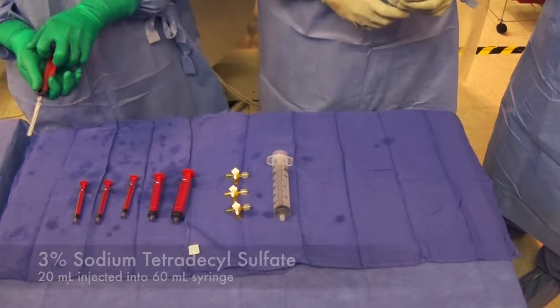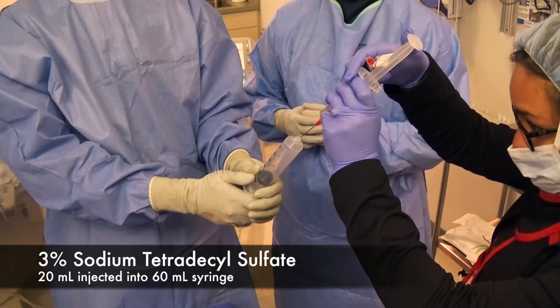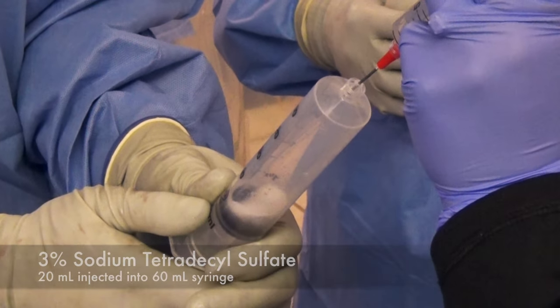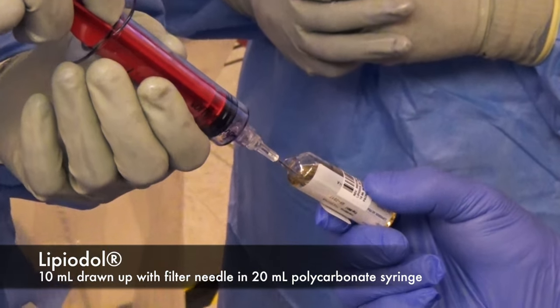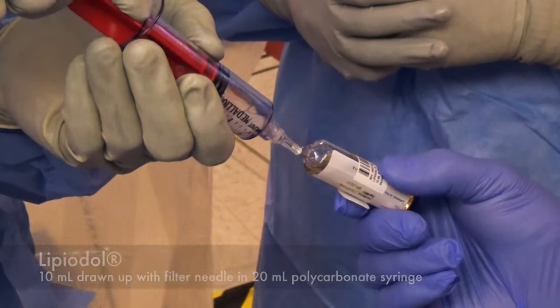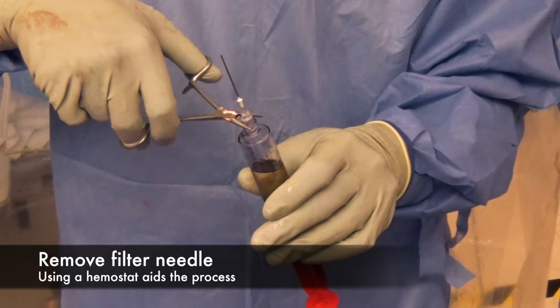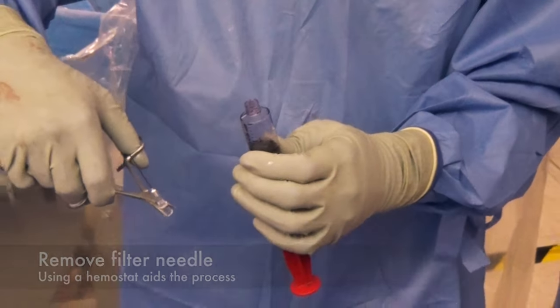We begin by adding 20 milliliters of 3% Sotradecol into the 60 milliliter syringe. Because Lipiodol comes in a glass container, we draw it up with a filter needle. The filter needle can become lodged onto the polycarbonate syringe. Therefore, a hemostat helps with removal.